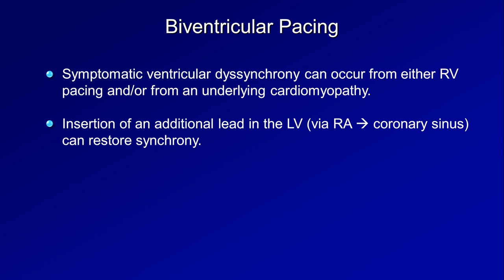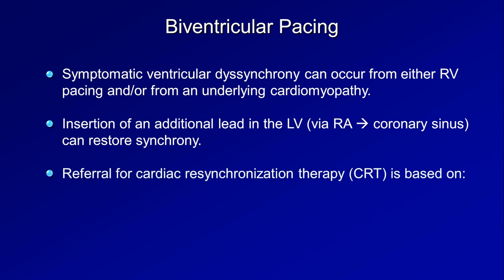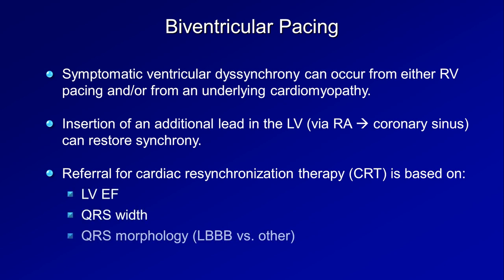The lead reaches the left ventricle by being fed from the right atrium through the coronary sinus and around the posterior side of the heart. This is known as cardiac resynchronization therapy, or CRT, and it is solely done in patients with systolic heart failure. Referral for CRT is complicated, but is primarily based on 4 parameters: the left ventricular EF, the QRS width, the QRS morphology, and the patient's New York Heart Association functional class.